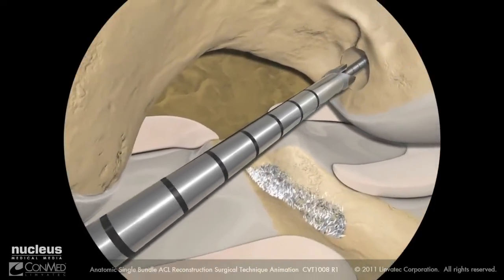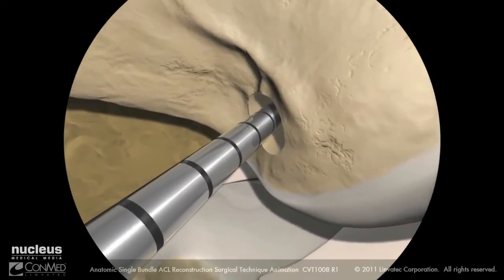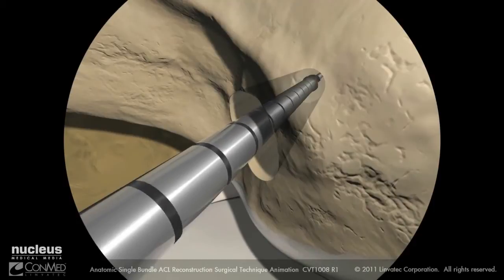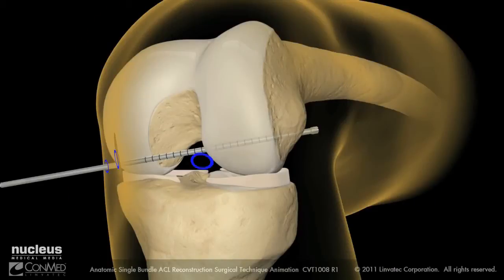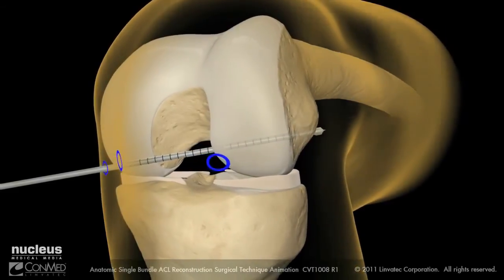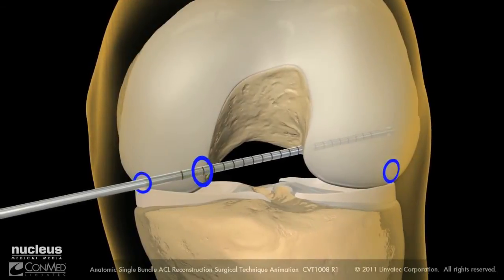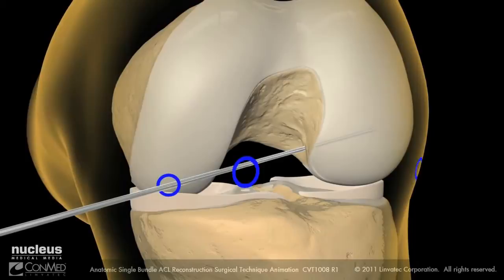Using the exo-button drill bit to drill the femoral channel, advance the drill bit through the lateral cortex. Using the exo-button drill bit as you would use a standard depth gauge, manually pull back on the bit to hook the head of the drill bit on the external femoral cortex to confirm the aperture to cortex length. Remove the exo-button drill bit, leaving the graft passing guide pin in place.